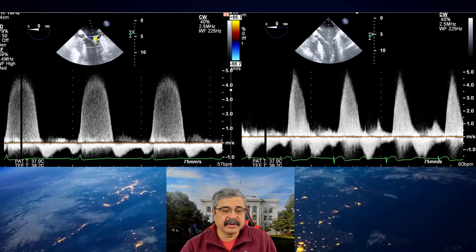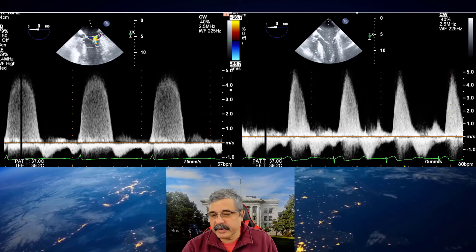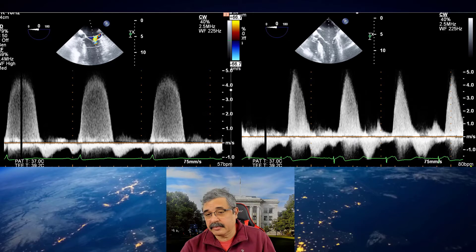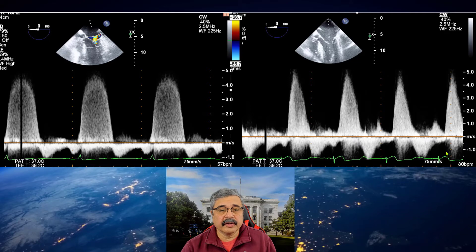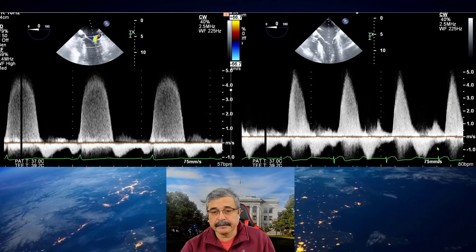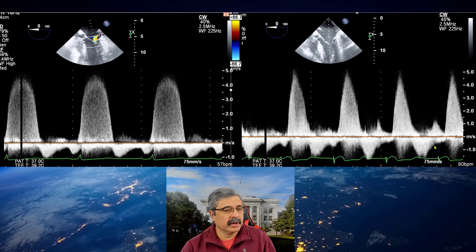At the same time, you can see that the heart rate on the left is 57 beats per minute, while on the right it is 80 beats per minute. The patient is tachycardic or hemodynamically unstable, and therefore the patient is becoming ischemic and having greater mitral regurgitation.